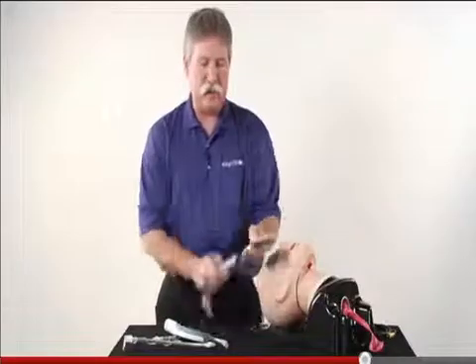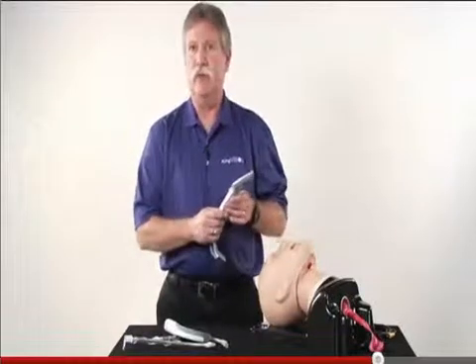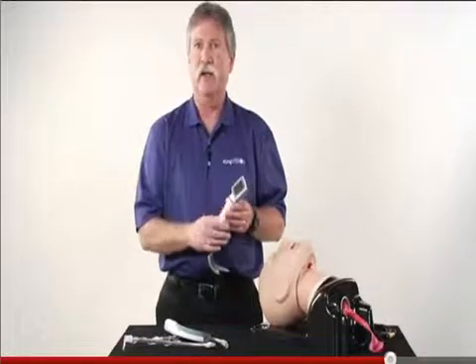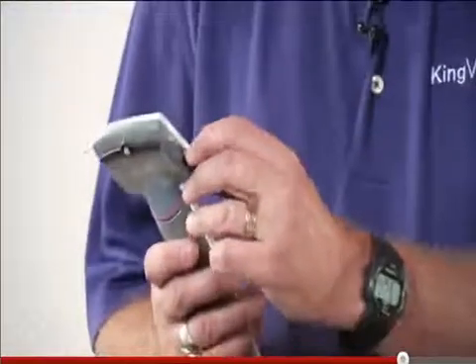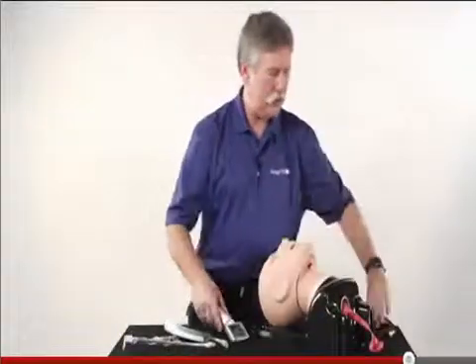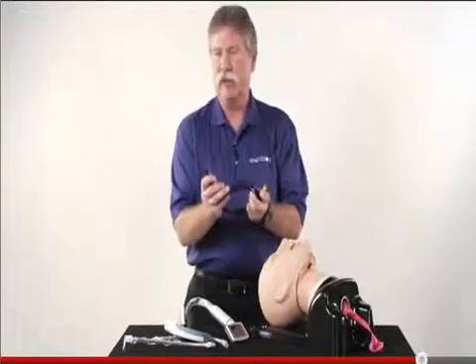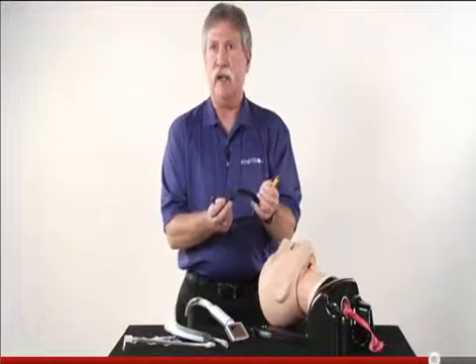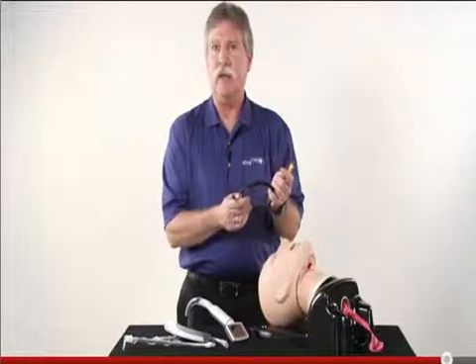The other nice thing about this is there is no focusing, no exposure control. There's automatic white balance, automatic focusing, and so you get a good image every time without having to futz with it. There is also a video out port that requires a specialized cable to connect. It's a mini USB, although non-standard. At the other end, it's a standard RCA plug to input into any video capture or external display.